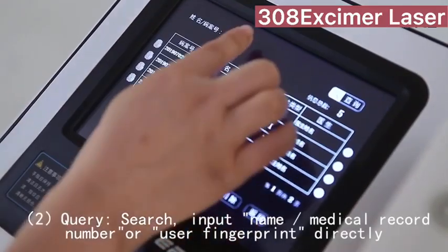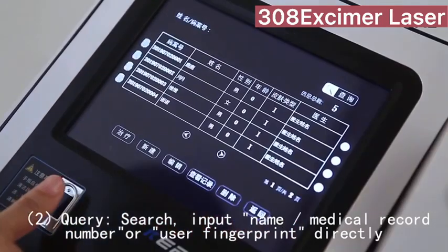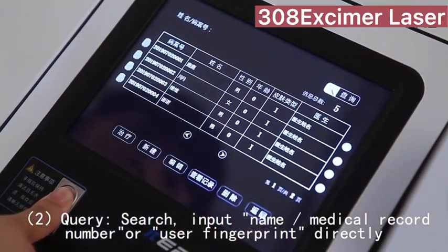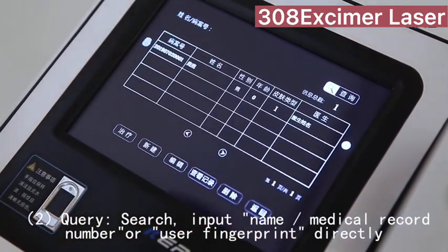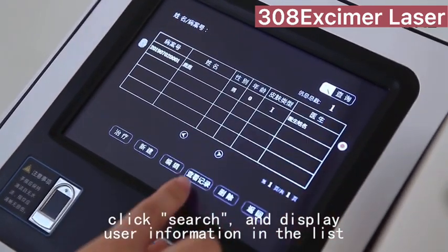To query a user, search by inputting the name, medical record number, or user fingerprint, then click Search to display user information in the list.